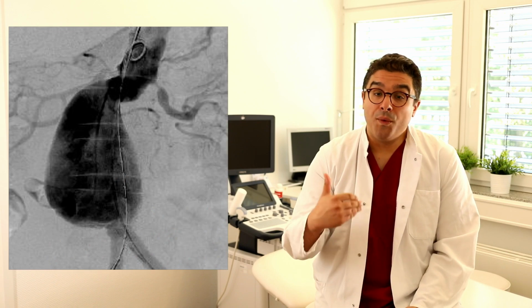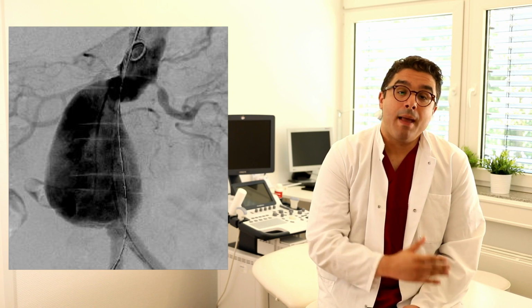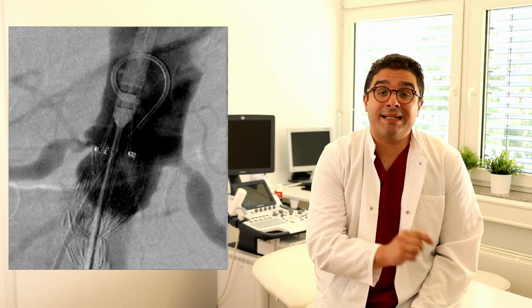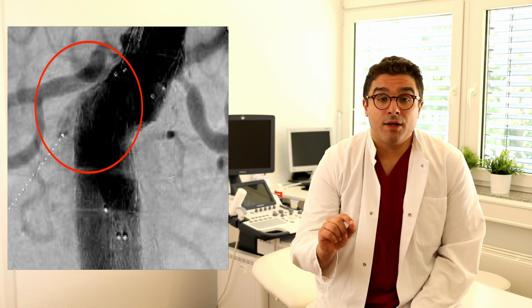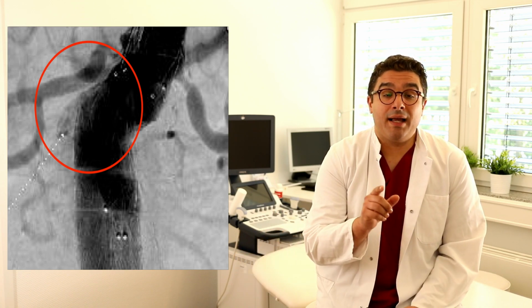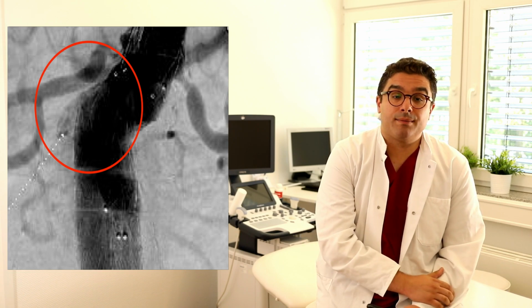The first type of challenging neck is the angulated neck. In this case, we deployed the endograft exactly below the lowest renal artery, but there was a slight migration of the endograft. It is common. However, this migration caused a type 1a endoleak, as you see in the final angiography. Here, you have to use again the Reliant balloon catheter, but if it doesn't work, I would recommend you either to use a proximal cuff or endo anchoring.